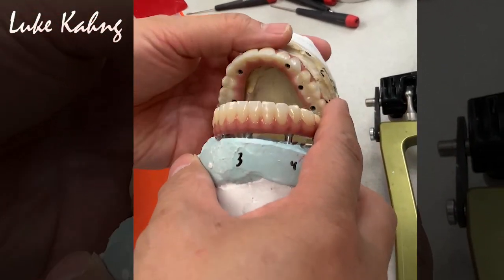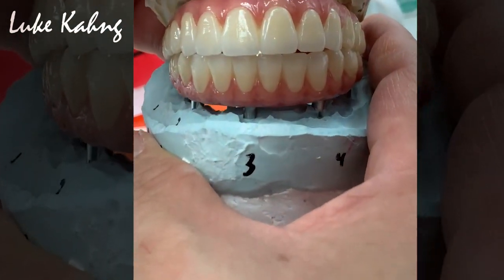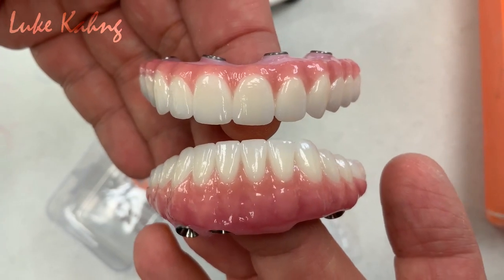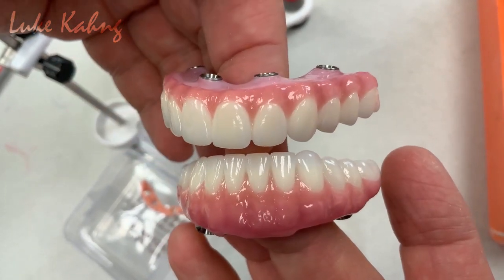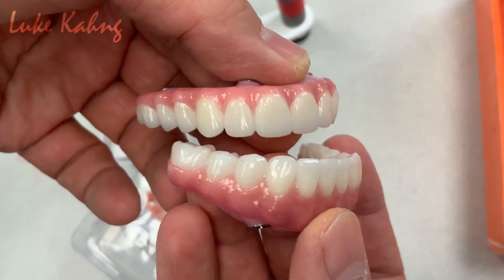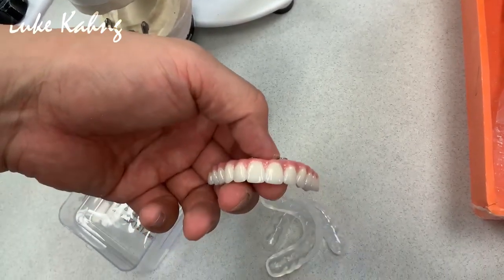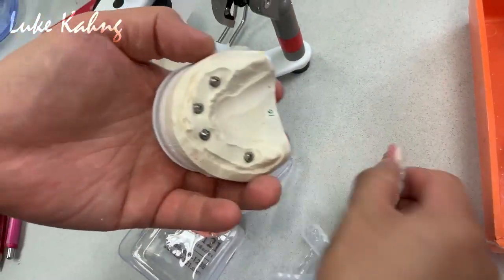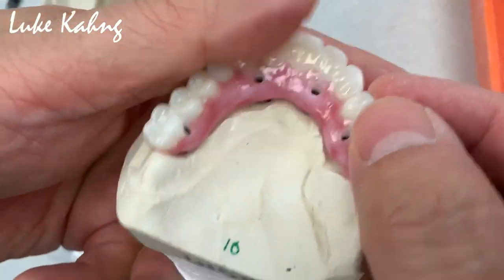Here's a double arch. This is the final. Alright, coming up, there is another 8 implant case. The smooth texture, this beautiful tissue aesthetics, the bleaching, the manual flick. Just want to make sure the implant seated all the way. That's good.